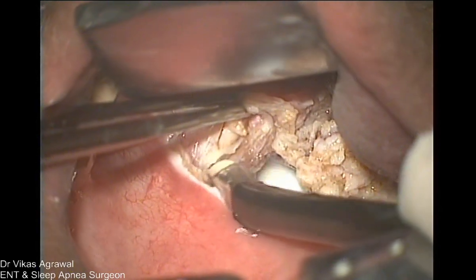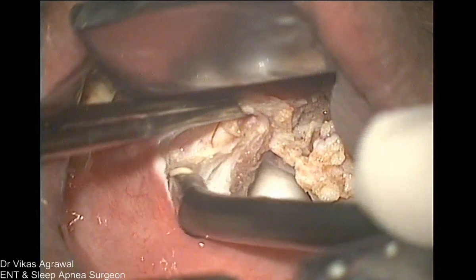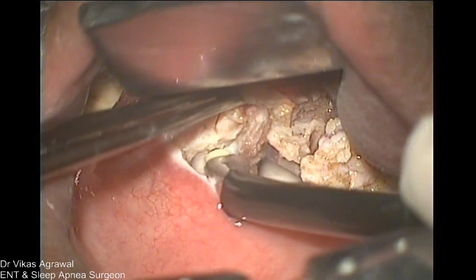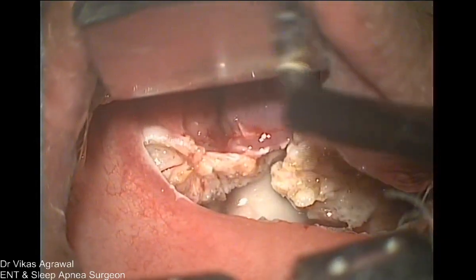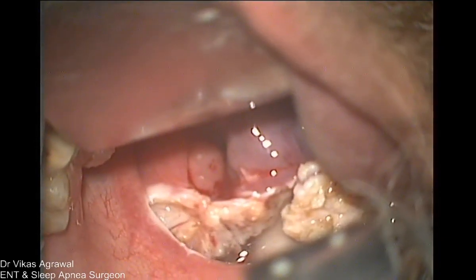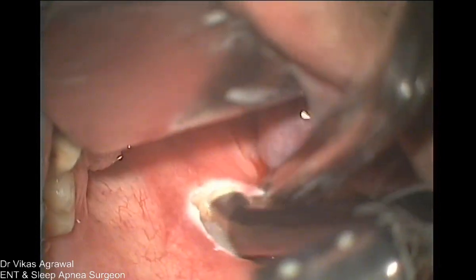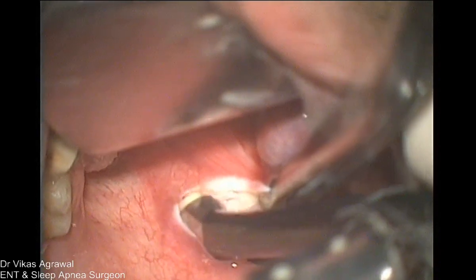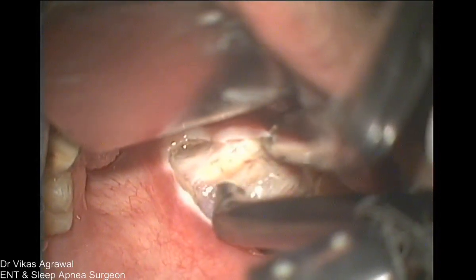Quite lateral. I'll take the Luc's forceps. Microscope reposition. Go lateral to the tonsil. Check out if my sound is going okay. Yeah, sound is excellent.